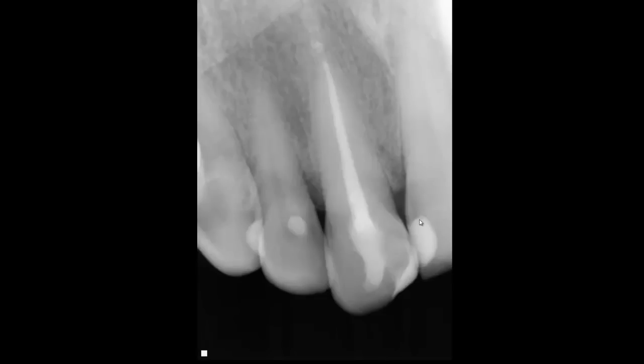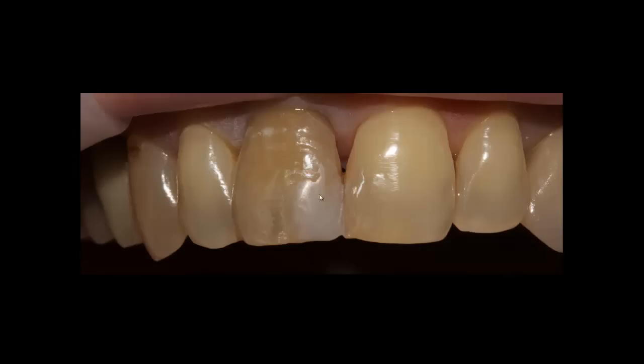On the X-ray you can see the root canal is done, there's no pulp, no infection. We also see composite filling on the mesial side, and number nine also has a deficiency in the composite so we have to change it as well. Because I didn't have a wax-up of number eight, I took a form of global composite and did the mock-up right in the patient's mouth, then scanned for the restorative stage.